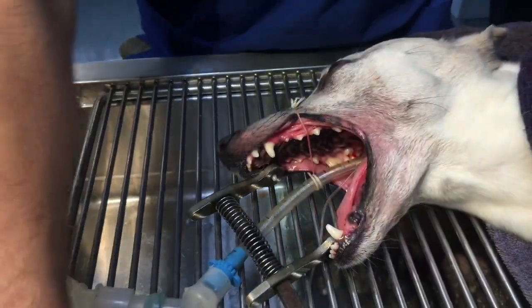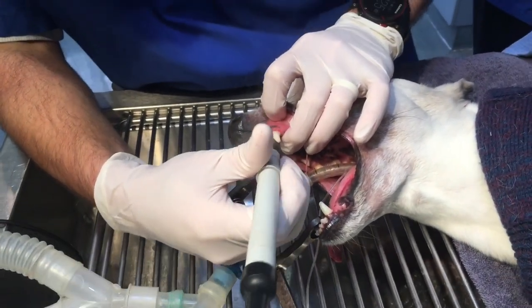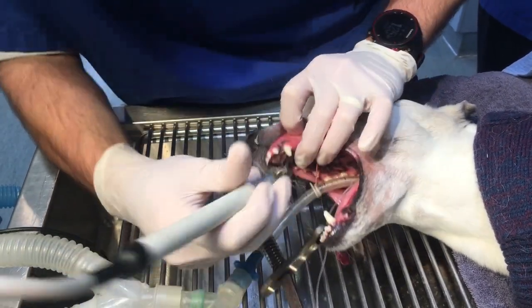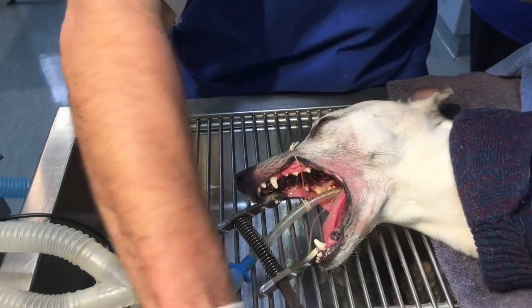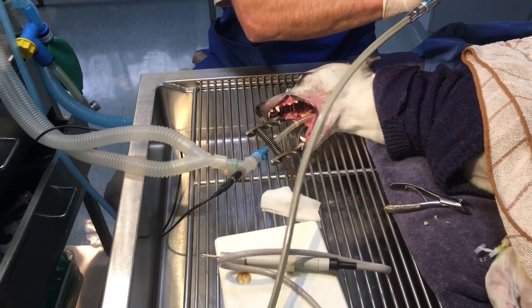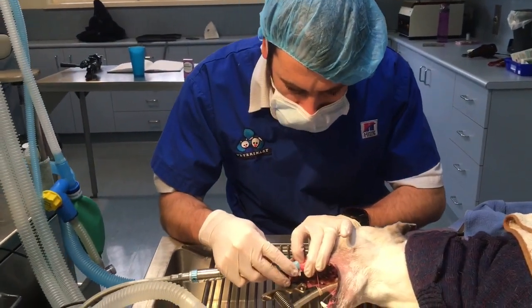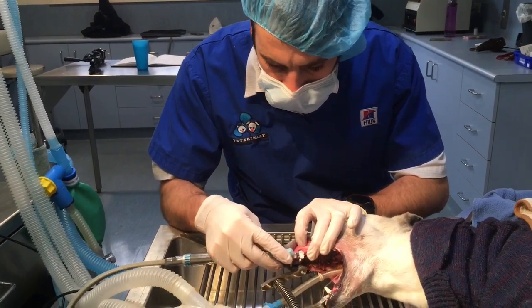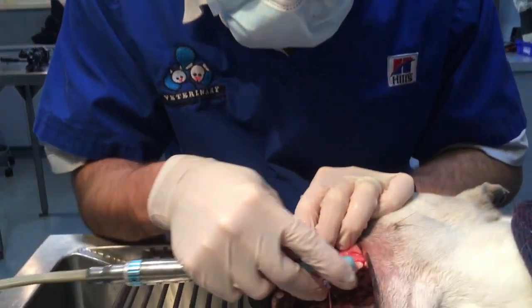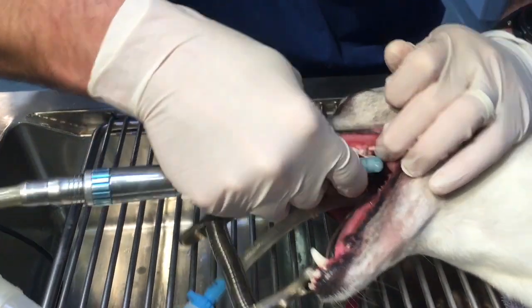We've just got a little bit of tartar still on the front of this canine. Now — polishing time. We've got this stuff called Profi Paste, and we use an oscillating little cup. It makes lots of noise, which it does very well, and helps try and get rid of any of the little grooves that we've put on there from the scaling. Same thing as what you get with your human dentist.